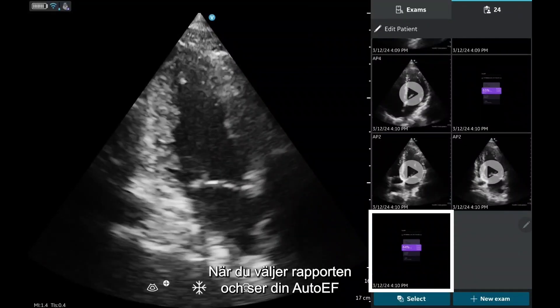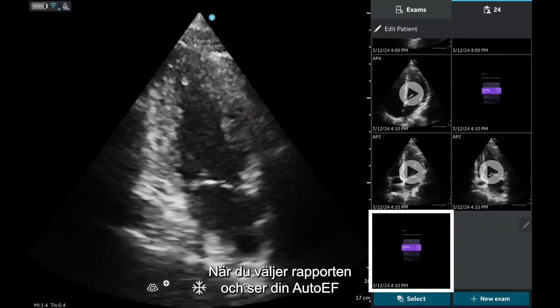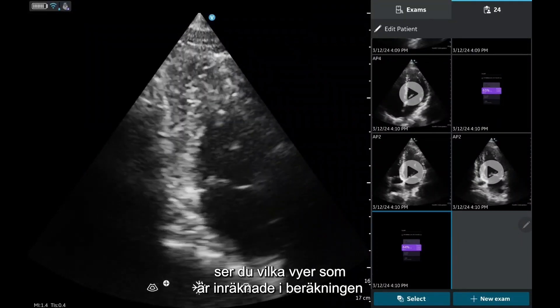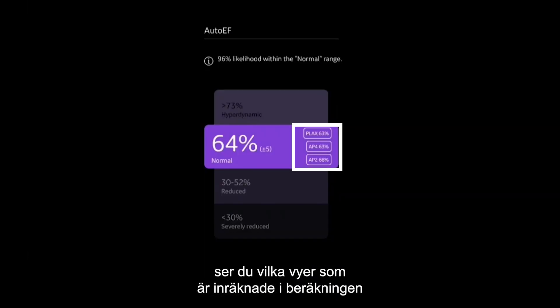When you select the report and view your final auto-EF, you will see which views contributed to the calculation and whether the auto-EF falls within the normal range.